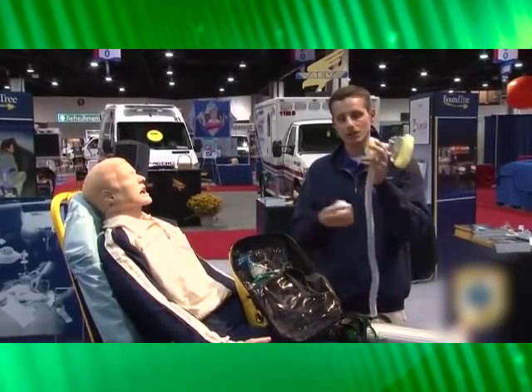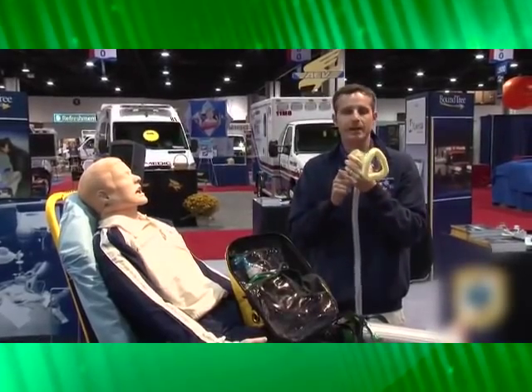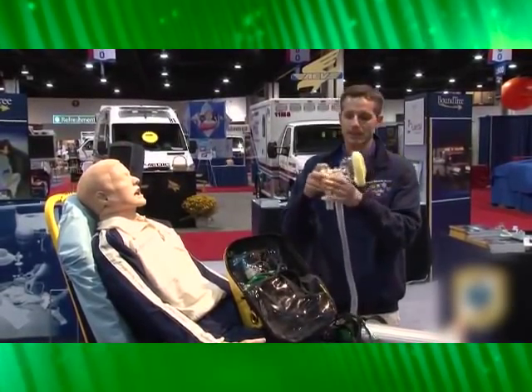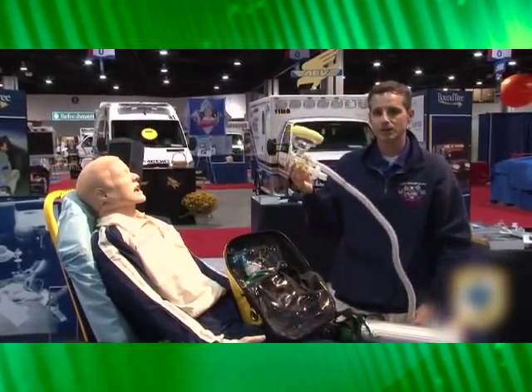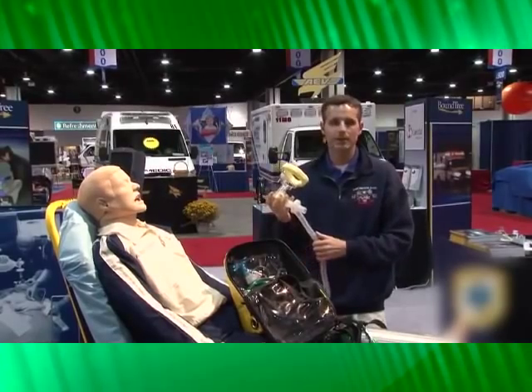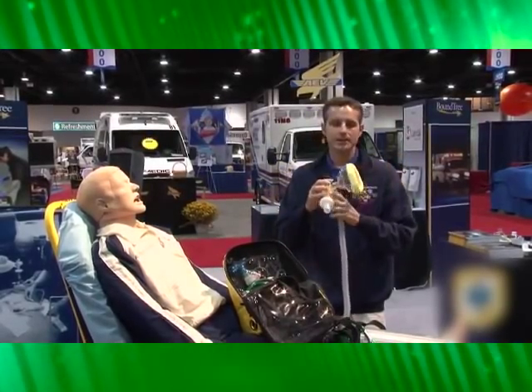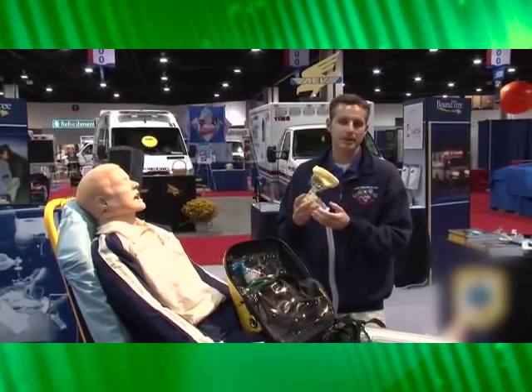When putting a patient on CPAP, everything they breathe out comes out at velocity because it's pressurized. So with each circuit you want to make sure you use the included N95 HEPA filter right on the exhalation valve. If you pick up a patient who has TB, SARS, MRSA, H1N1, or any other disease and they exhale, cough, or sneeze into the system, you're going to make sure it gets filtered out and not spread to your medics.